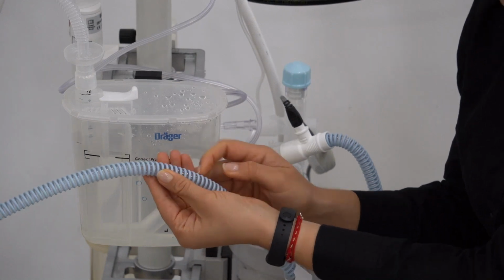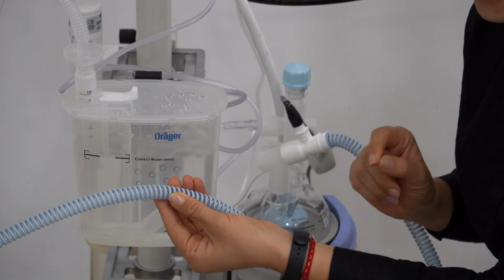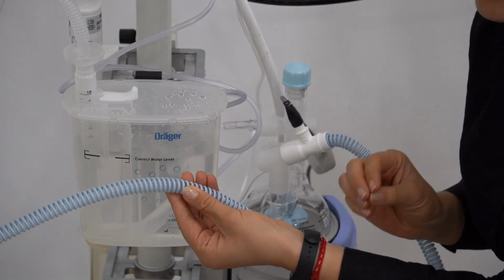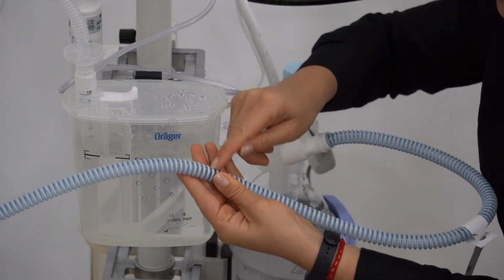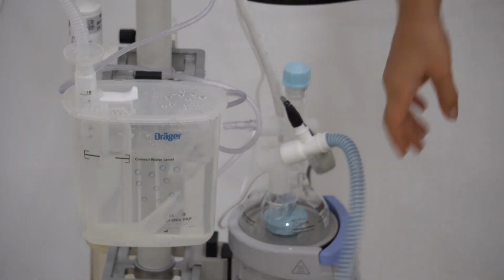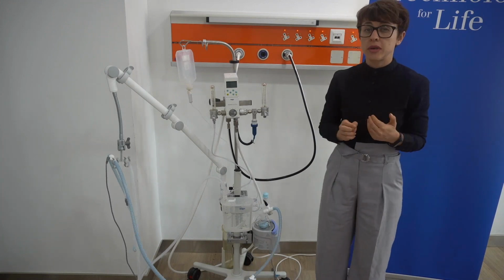So we don't have any lines that go inside the circuit, because we know that these lines can potentially increase the resistance in the circuit and can also influence the effectiveness of the CPAP system or of the CPAP therapy. That's why we are using the circuit with the warming element located on the outside of the circuit. Also, Linda has mentioned that on the expiratory side, it is important to have a smooth bore circuit.